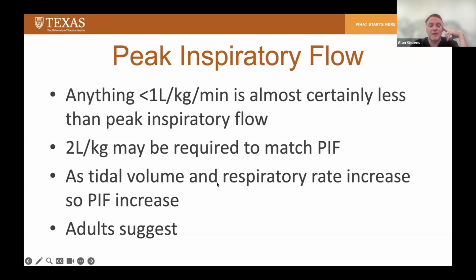So in the adults, they suggest, and I'm sorry, there's a typo on the screen here, they suggest 10 times your minute volume should be your best estimate of what your peak inspiratory flow is.